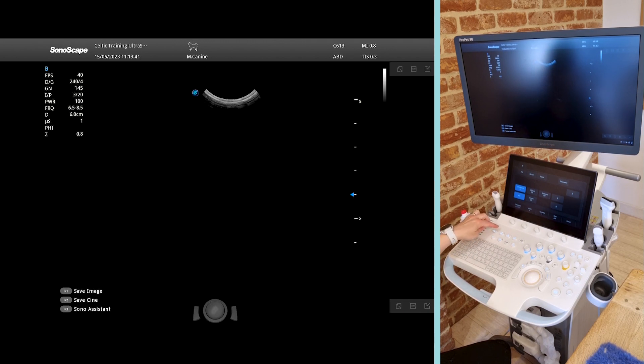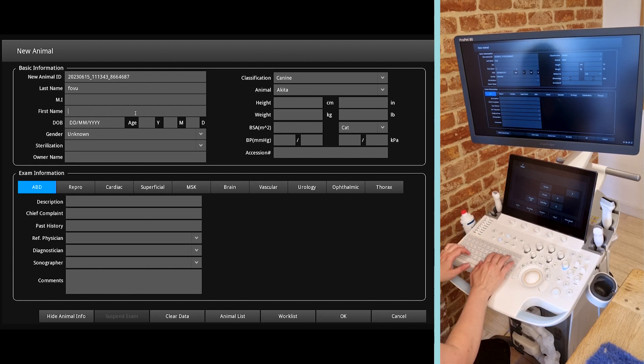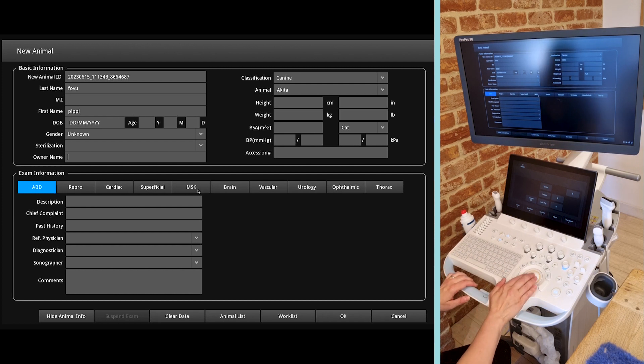I'm going to put in our patient details. Up at the top here you can see we can move with our trackball to select. We'll enter the surname Fovu and first name Pippi, and choose abdomen. We can put in lots more details — particularly weight, which is useful as this will do lots of calculations for you, especially when heart scanning.